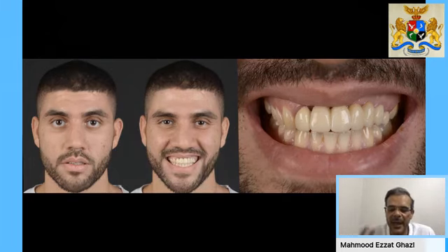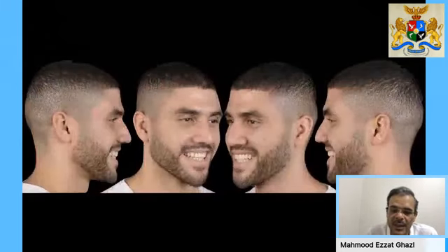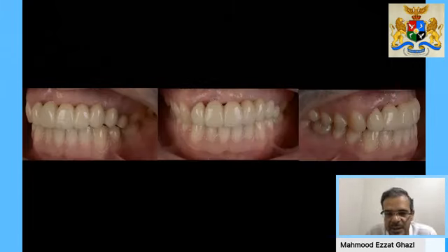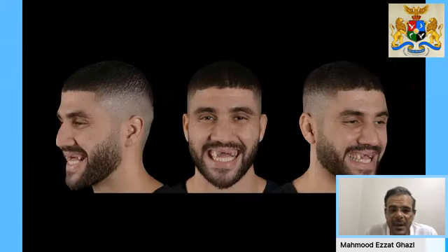here digital treatment planning comes in, and the advantage of visualization gives you an overview of what you can do for this case exactly. This patient had huge psychological problems because of his teeth. He was getting married in a few months, and he wanted a solution for the position that he was in right now. So his expectations were very high. He had visited many dentists who told him that there was no way they could give him natural-looking restorations. As soon as I saw the case, I said the same. But I usually never give my patient final options unless I have treatment planned the case to the full.